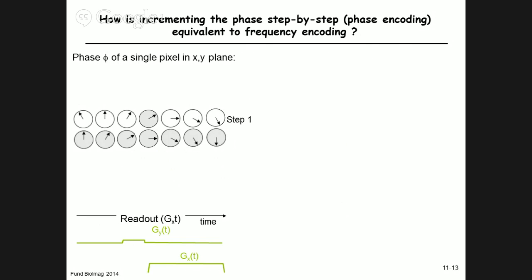We're looking at a single pixel in space. Okay, we're looking at just what's happening in time. This axis is the readout time, and now one repeats the experiment by turning on the gradient and fills that into the computer. So what we're looking at is the elements of the matrix that are being filled.